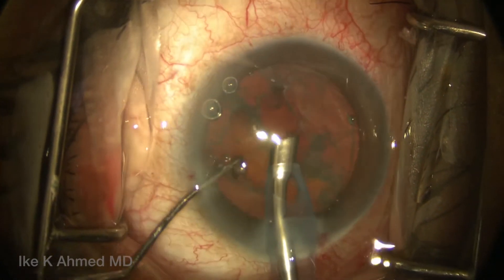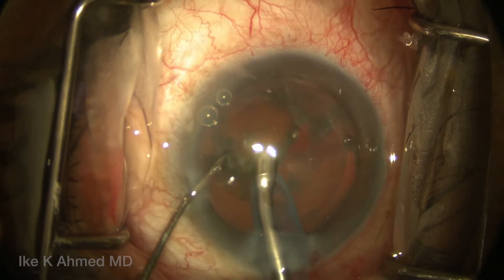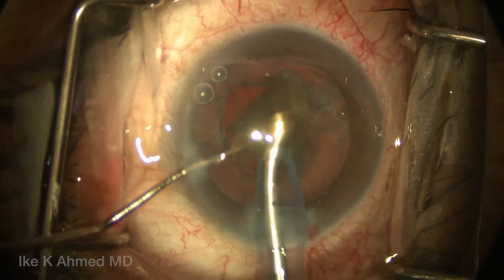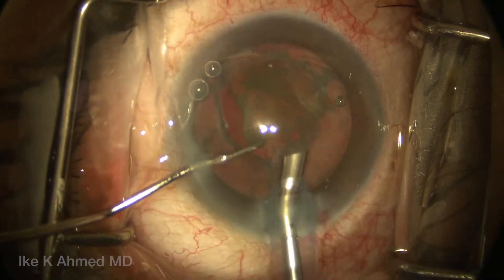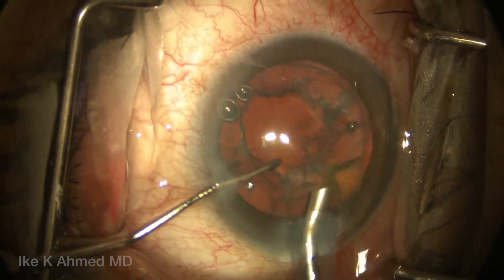The remaining hemi-nucleus is rotated to provide an attack angle of 45 degrees coming from the center to the periphery. Once we have purchased the nuclear material, we bring it to the center again and emulsify it with the help of the chopper to carousel the nuclear fragments.